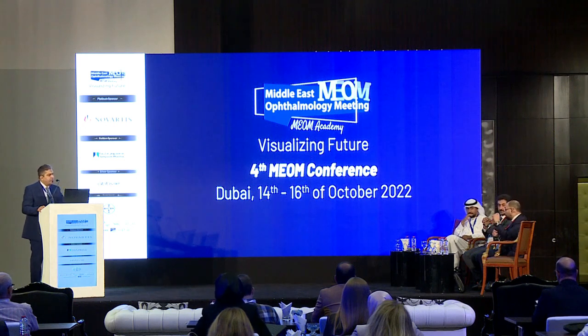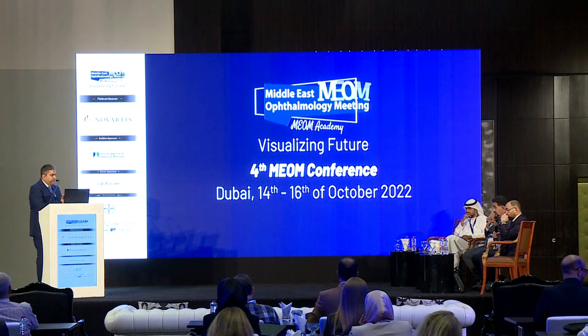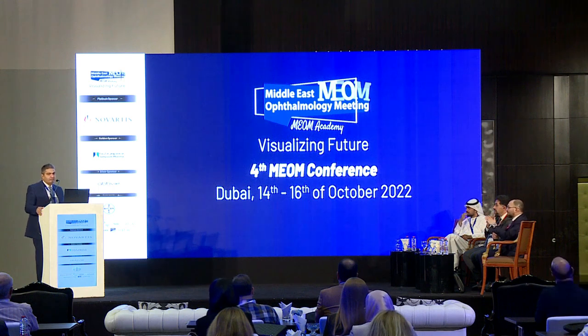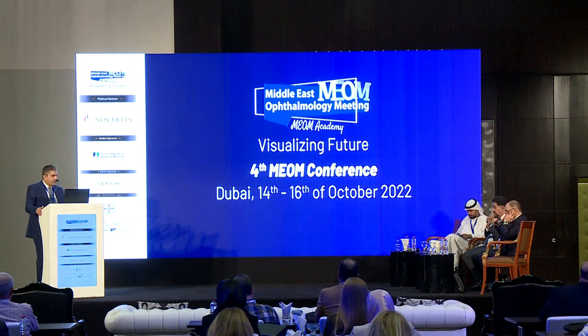That's good. So that's one of the important points, especially the repeatability. We need repeatable examinations. Yes, the message I say, Dr. Safwani, is if you find any problem in the CBI, just try again, and you have a normal Pentacam. But if I have a normal Pentacam and a normal CBI, so it's a normal cornea. So if you want the final answer to your question, whether it's a normal cornea or not, just repeat. Maybe not at the same time; maybe I can give the patient 1 week, 2 weeks, as other causes may happen. But I agree with you that it's a repeatable exam and it's not only decisive.